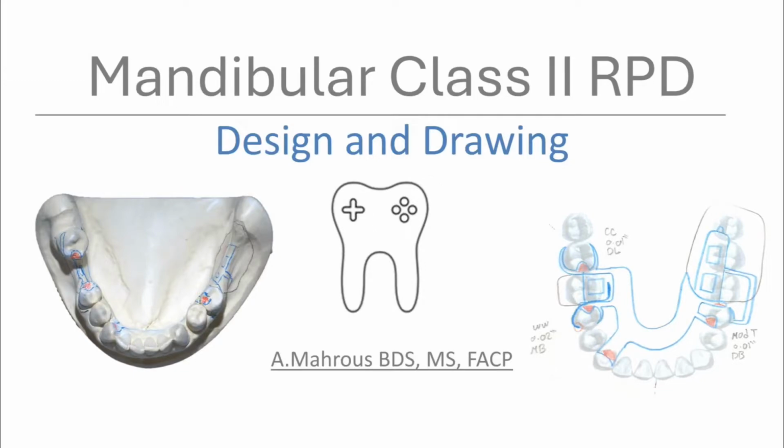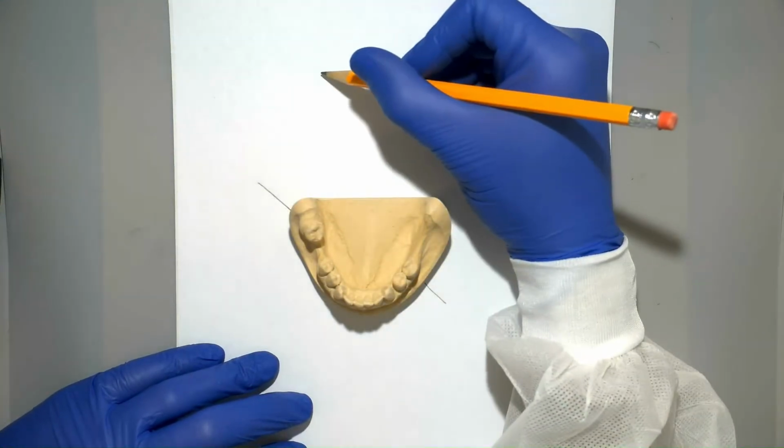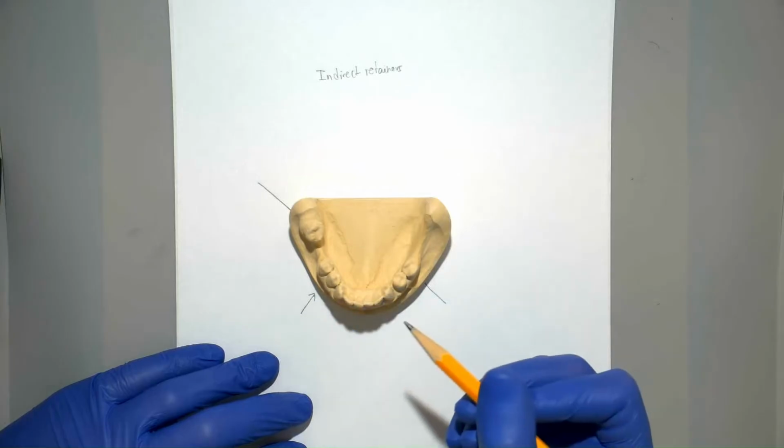In this video, we'll go over how to design and draw a Class II Mandibular RPD. Before we start, it's important to have a plan. Since this is a Class II, you'll notice we'll have a fulcrum line going between the last two abutments, meaning we will need indirect retainers, which is usually perpendicular to the fulcrum line about here.